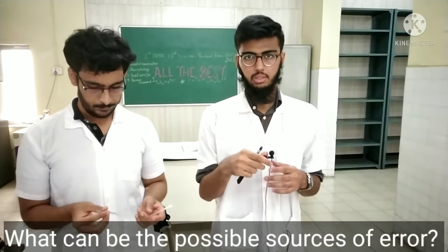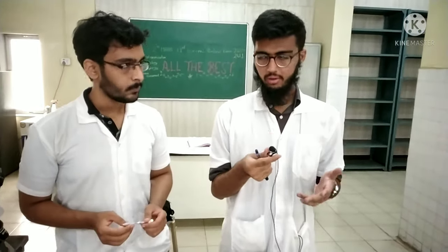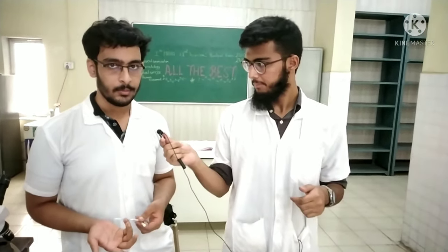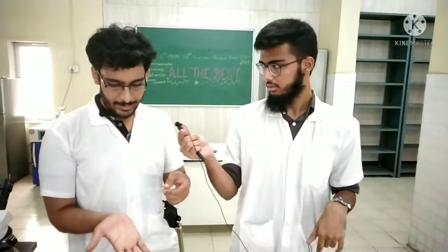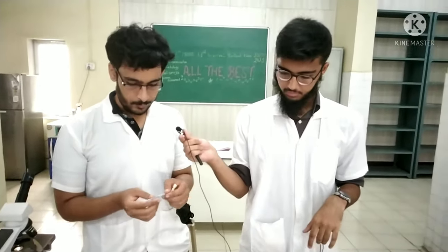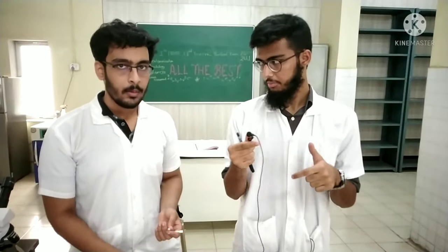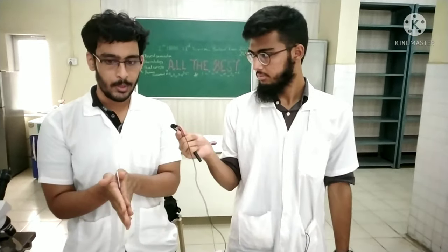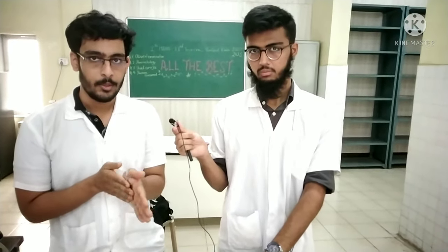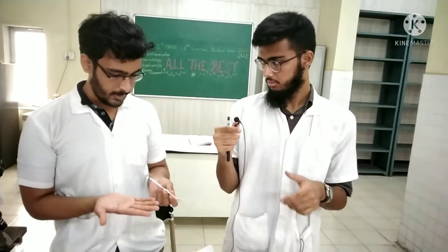Now we will discuss the possible sources of error and how to minimise them. If the pipette is wet, clean and dry it. If blood is sucked beyond the 0.5 mark, tap it against your palm to bring it below the 0.5 mark. If air bubbles form while sucking blood, prick the hand carefully and suck the bulb again. If there is sedimentation of RBCs in the bulb, roll the pipette in your palms to mix the blood and fluid well. We discard the first few drops because they mostly contain diluting fluid.